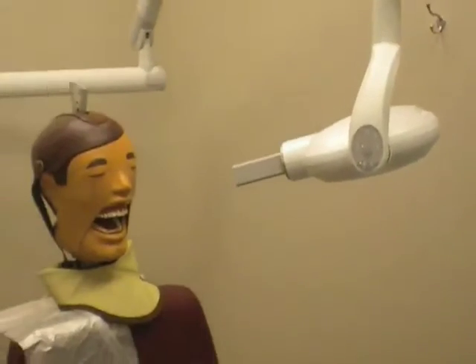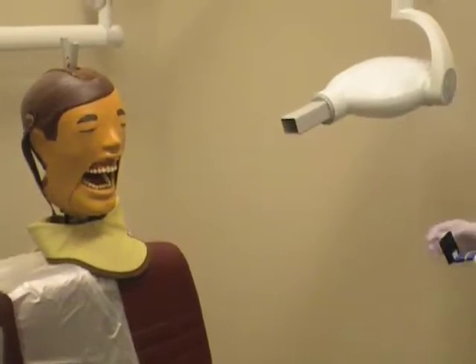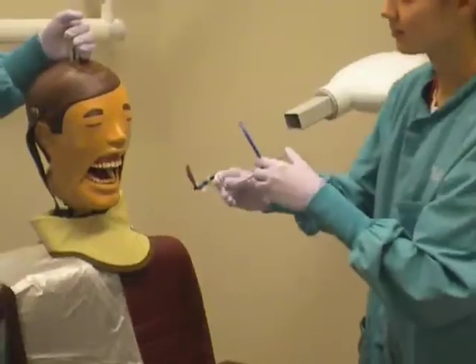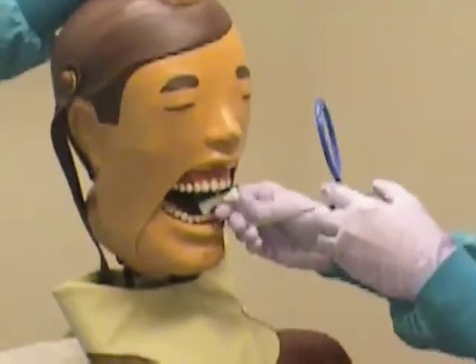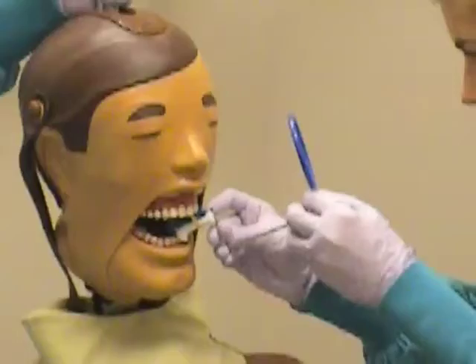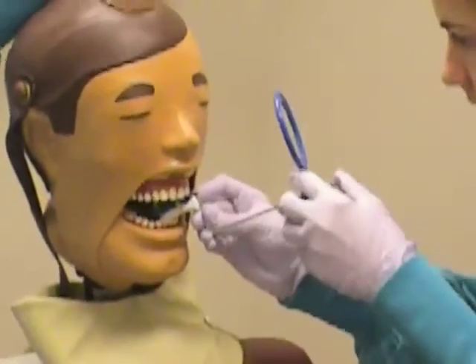Ask the patient to remove any items such as glasses that may interfere with the exposure. Ask the patient to open his mouth and insert the phosphor plate into the mouth, keeping the black side facing the operator. Place the bite block up to the tooth being imaged, centering the canine. Ask the patient to slowly close his mouth to stabilize the instrument.